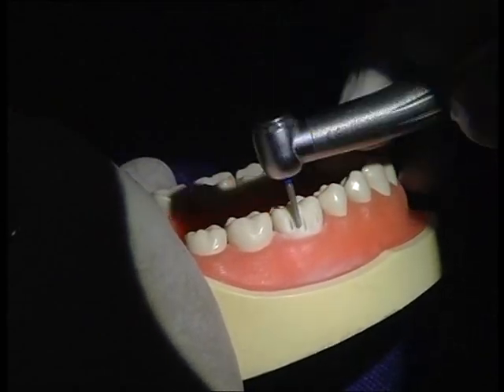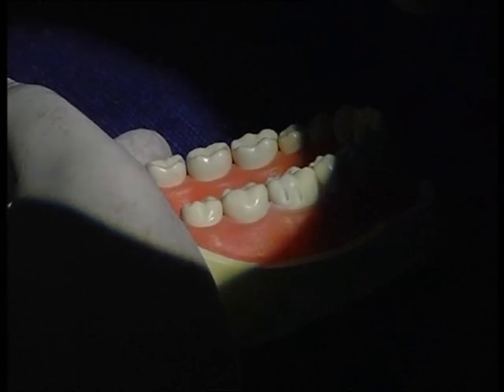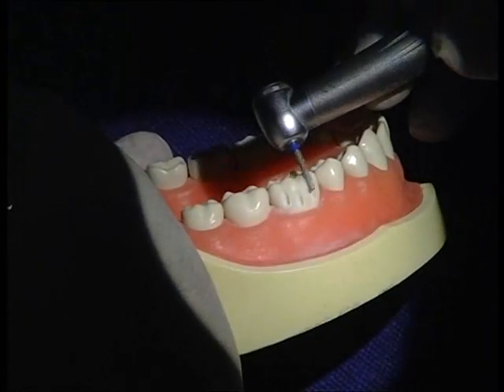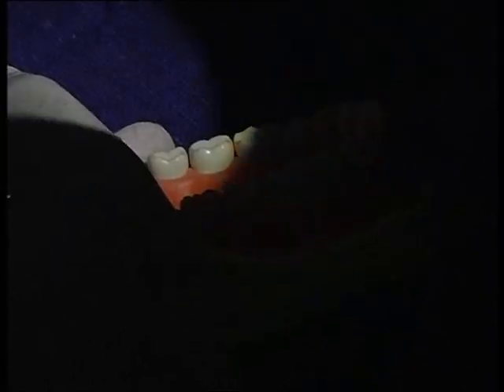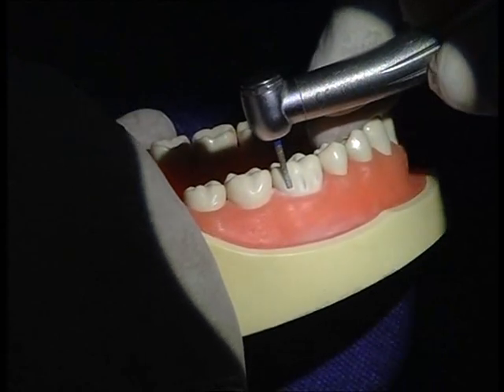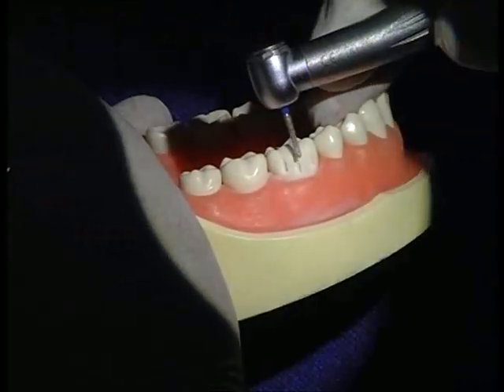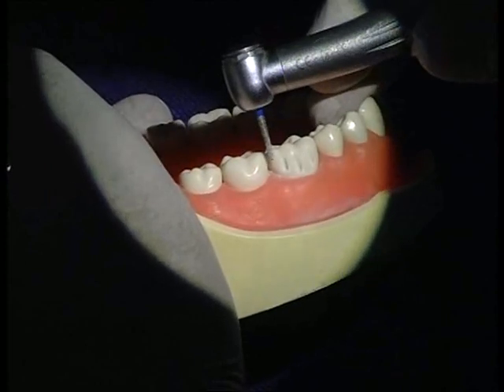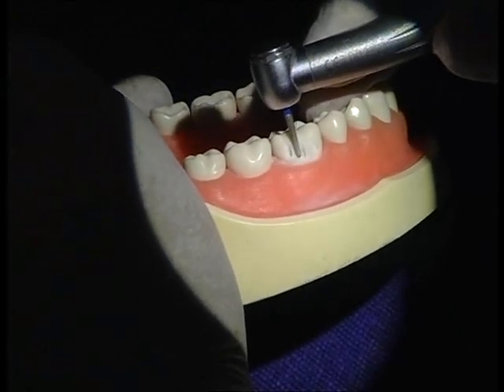Plane two: these are my three depth grooves in plane one. Do I give depth grooves in plane two? No, I don't give depth grooves in plane two at all — because this is my functional cusp, and when I'm eventually reducing the functional cusp that entire surface will go off completely. So no need to reduce that now. All I need to do is connect this to this. When connecting, I can move either direction, but I cannot move forward and back — else these grooves will keep going deeper. Always go in one direction, lift, come back, go in the same direction. You'll appreciate that from the sound the aerotor makes.